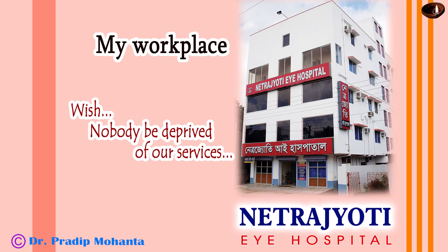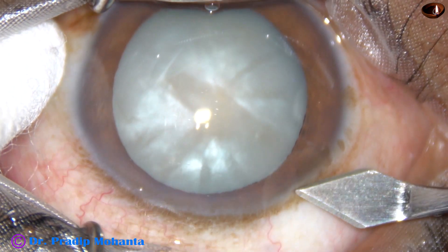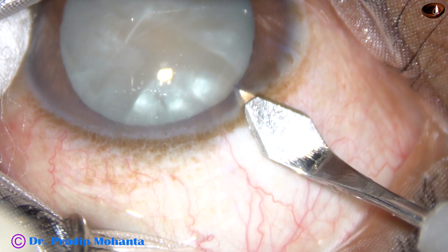Friends, welcome to my workplace at Hrana Ghat, West Bengal, India. This is management of an intumescent cataract. Let us observe the surgical steps.